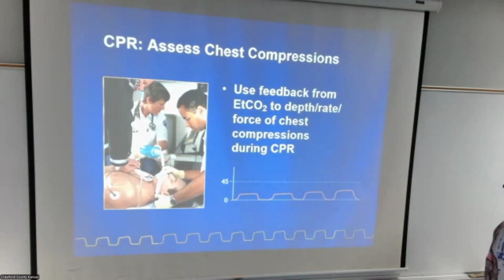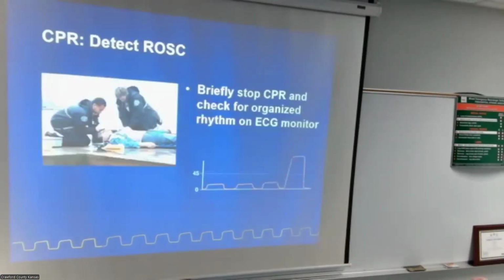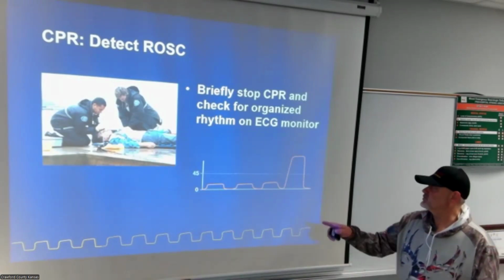They'll give you a line to follow. Higher the line, better compressions. So briefly stop and check for an organized rhythm. What happens?